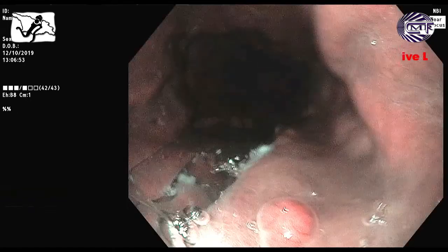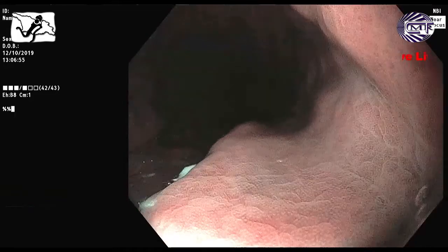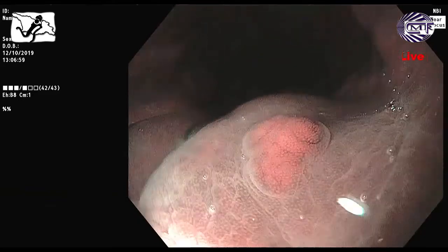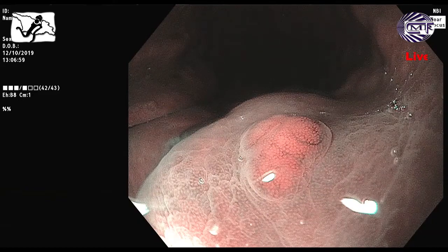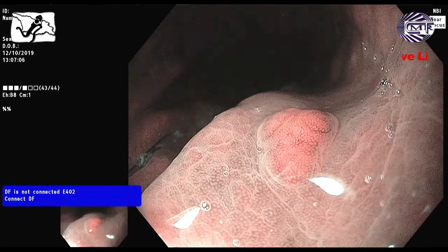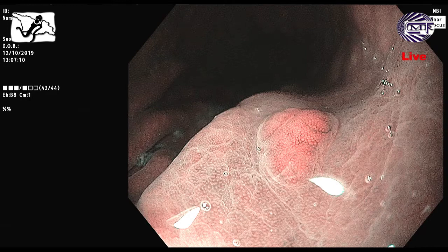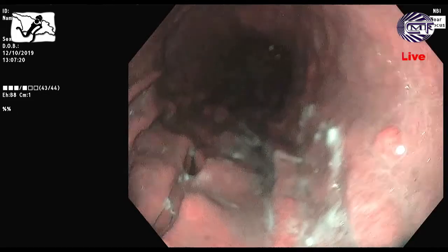This is polyp again. Yes. How about it? To compare with the surrounding area, almost the same, right? Yes. A little bit hypervascular, right? But basically the honeycomb shape like this. Maybe more reddish. Yeah, just reddish, right? Yes. Relatively hypervascular. That's all. I think I suspected this lesion was the foveolar hyperplasia, not malignancy, right?